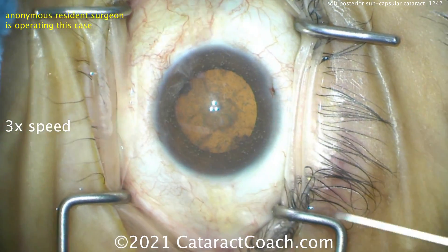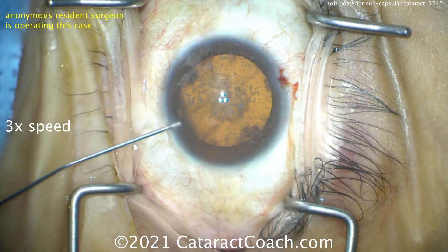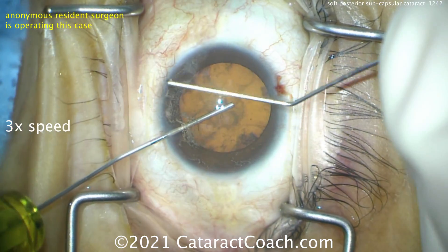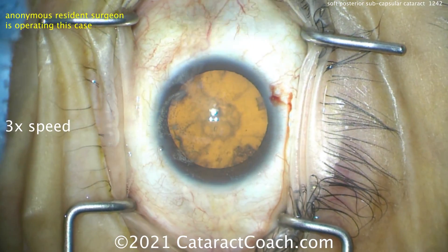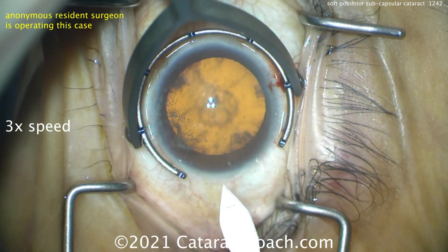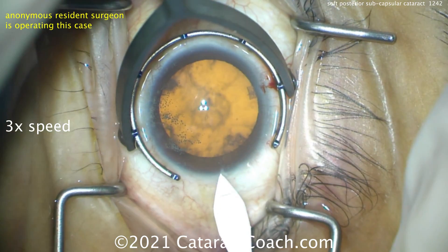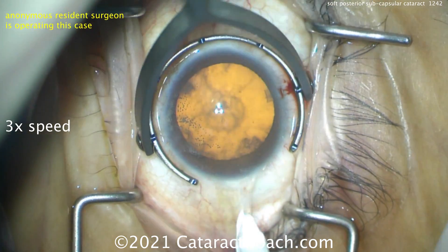Sometimes it's tough for the resident to come across the eye and not flatten it, so we're going to put a little extra viscoelastic in the eye. Good wave — good job, get the pressure normal. Let's make that main incision. This is a resident who has maybe about 30 cases of experience, doing this together with the professor here. Making an incision — let's see how that goes. That looks pretty reasonable, I'll take it.